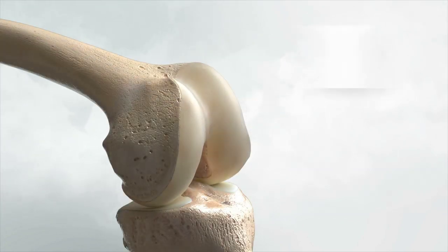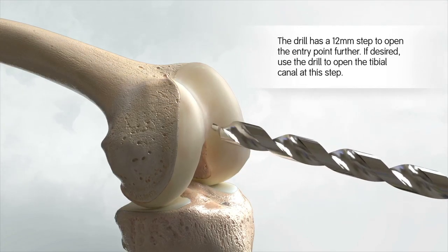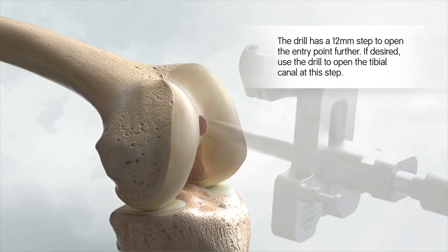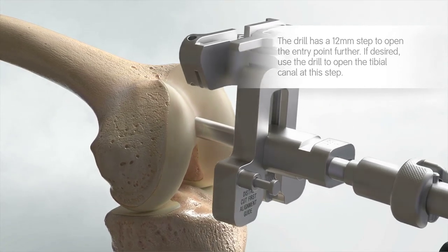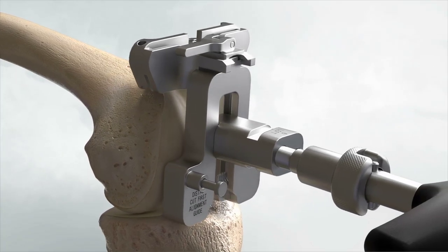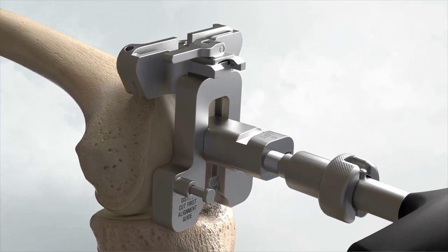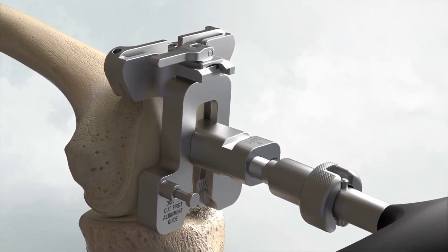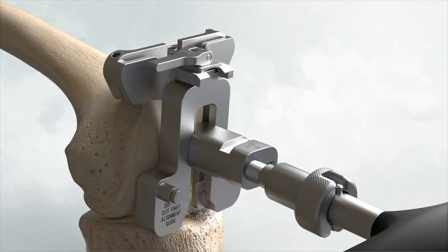Open the femoral canal with the 9.5 mm intramedullary drill. Slide the intramedullary rod of the assembly into the femoral canal until the alignment guide contacts the distal femur. Orient rotation of the assembly neutral to the posterior condyles, and impact one or both of the floating spikes into the distal femur.